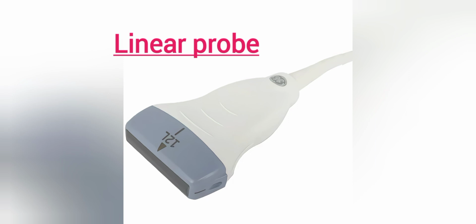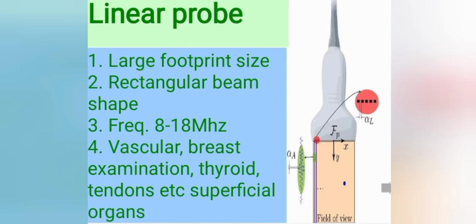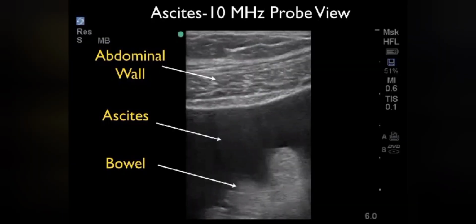Linear probe, the features are large footprint size, rectangular beam shape. Very high frequency used in this probe is 8 to 18 megahertz. Linear probes are generally used for vascular, breast examinations, thyroid, tendons examinations. These probes are very good for superficial examinations.